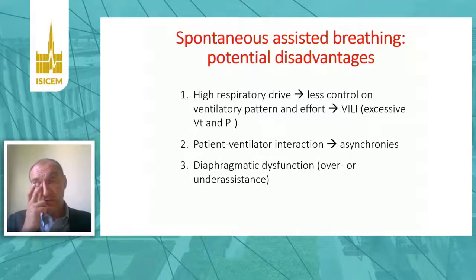But also there are important and potentially very negative disadvantages. In particular, patients who retain spontaneous breathing activity may have higher respiratory drive, and in this case develop a ventilator-induced lung injury, as you can see shortly.